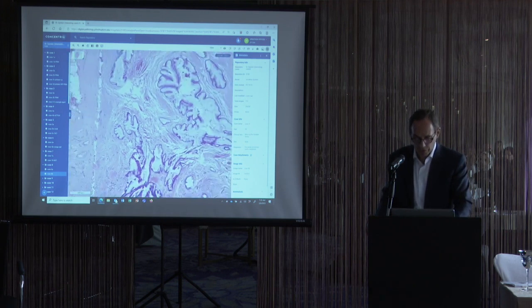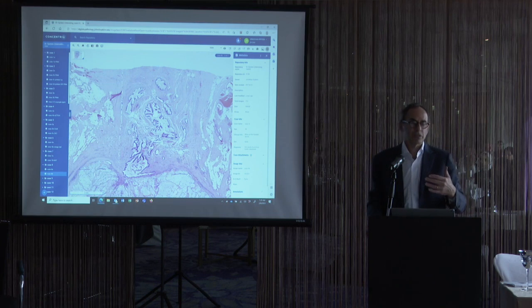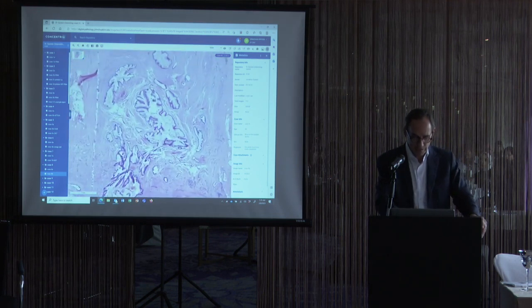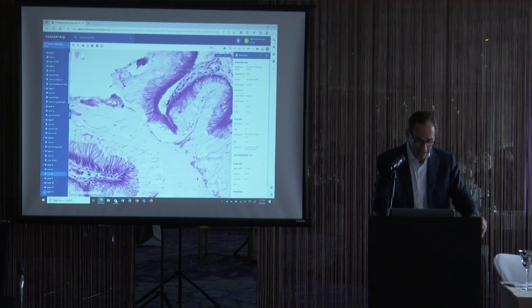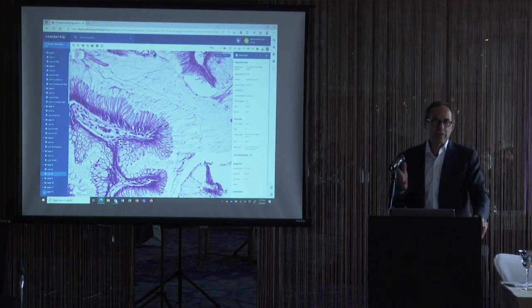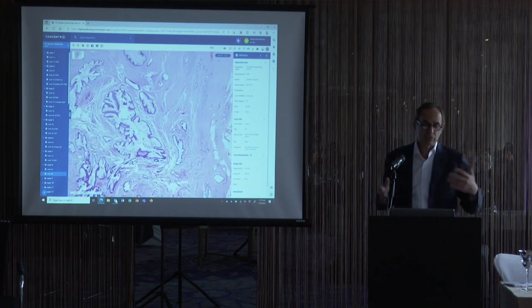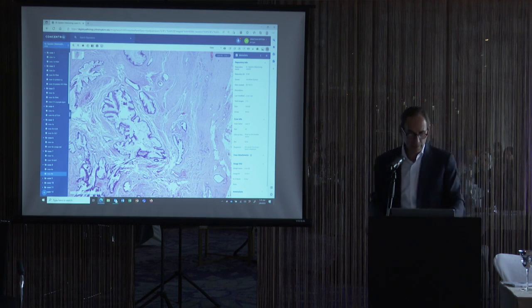The way to approach urachal lesions is you have to think of them as intestinal lesions, because that's what they are. It's intestinal metaplasia. If you were to have this in the appendix, with some areas of very bland mucinous epithelium, other areas a little more adenomatous, filled with mucinous epithelium, we would call this a LAMN, low-grade appendiceal mucinous neoplasm. So in the bladder or the urachus, this is a low-grade urachal mucinous cystic neoplasm, entirely analogous to what you would see in the appendix.